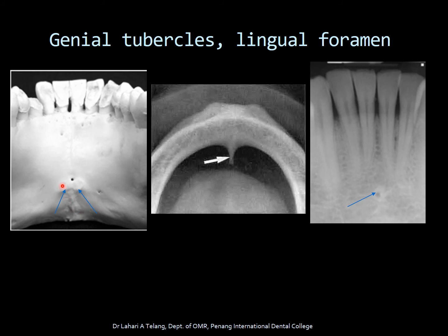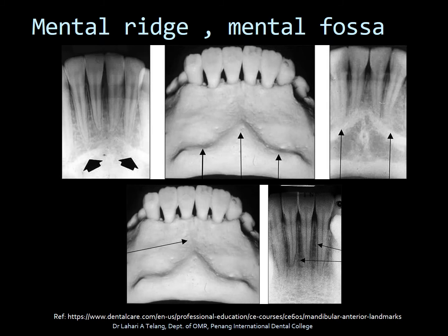This anatomy shows you the lingual foramen and the location of the genial tubercles. The mental ridge is a dense radiopaque structure visible as radio-opaque lines indicating the shape of the bone. The radiolucent area is the mental fossa, seen on this radiograph. You can also see the lingual foramen in this radiograph.